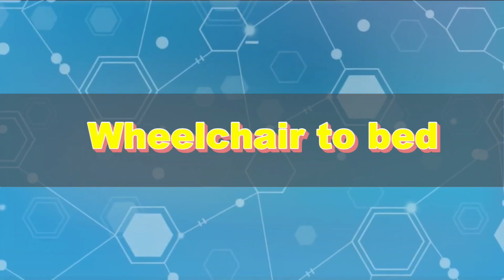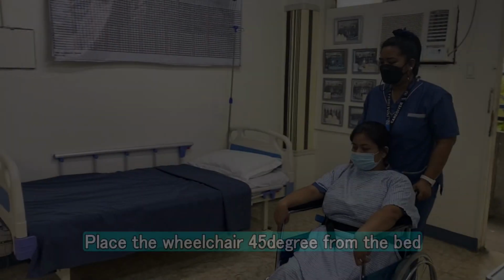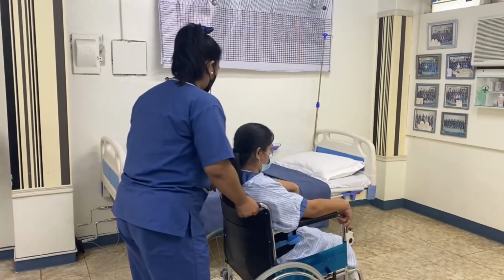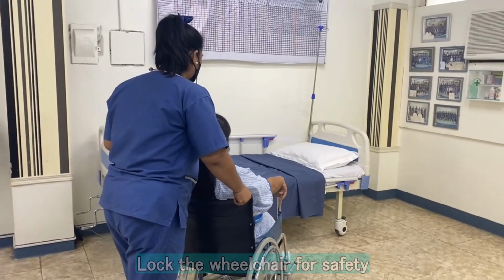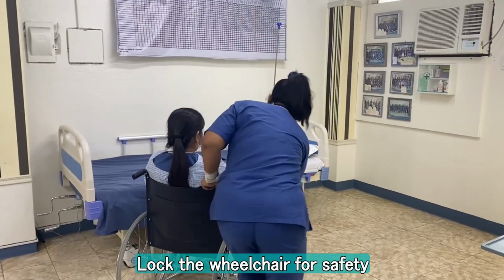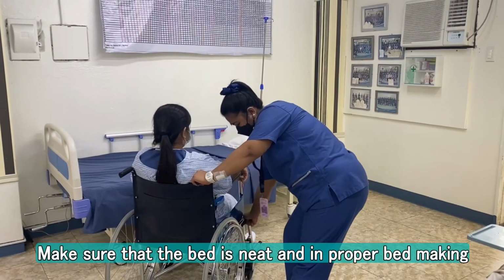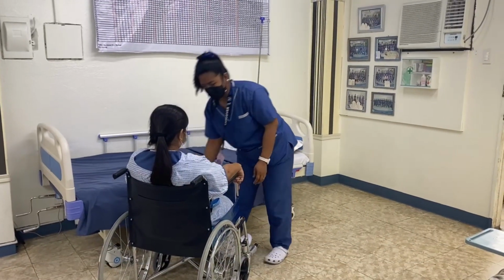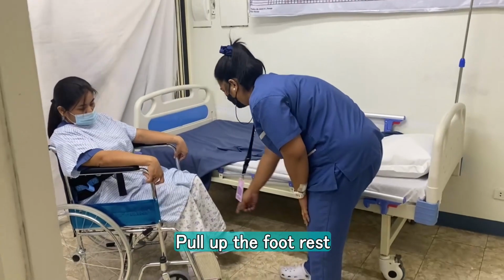Wheelchair to bed. Place the wheelchair 45 degrees from the bed. Lock the wheelchair for safety. Make sure that the bed is neat and in proper bed making. Pull up the footrest.